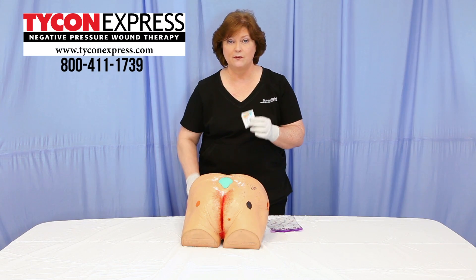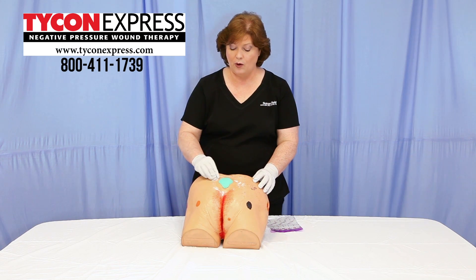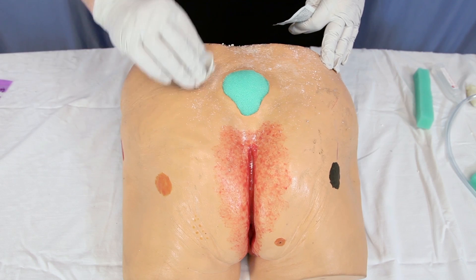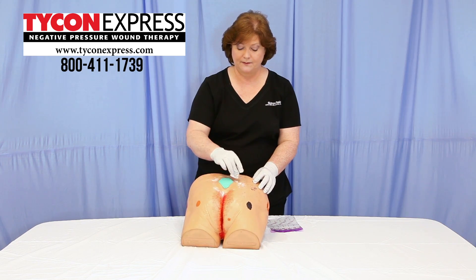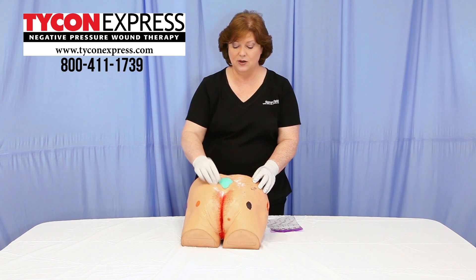Take an additional skin barrier wipe and go over it again in a dabbing motion, covering the powder that you've just applied. This technique is called crusting.